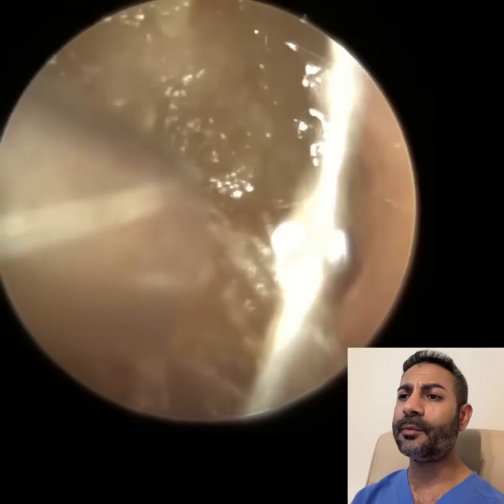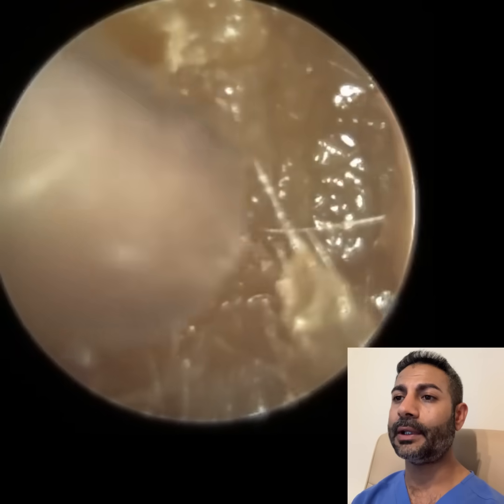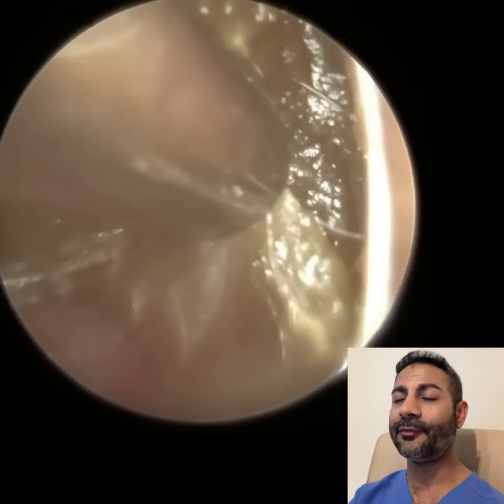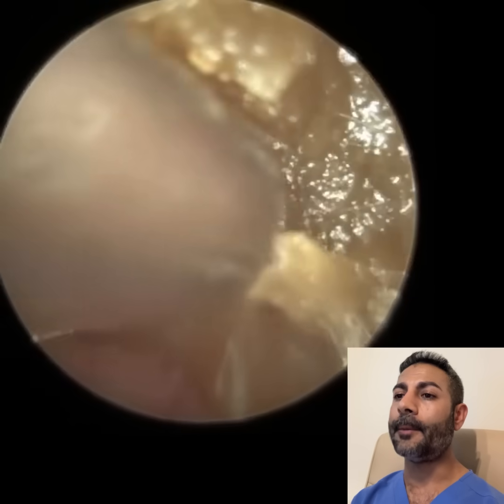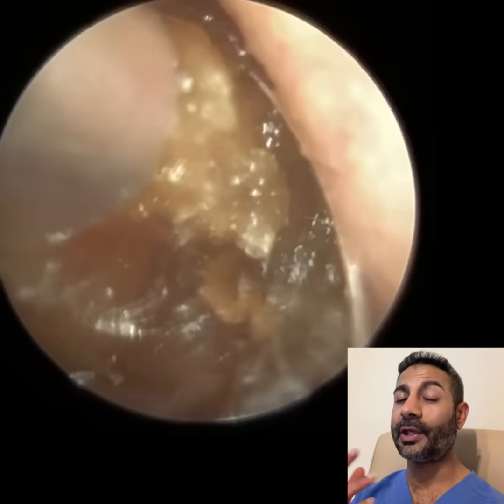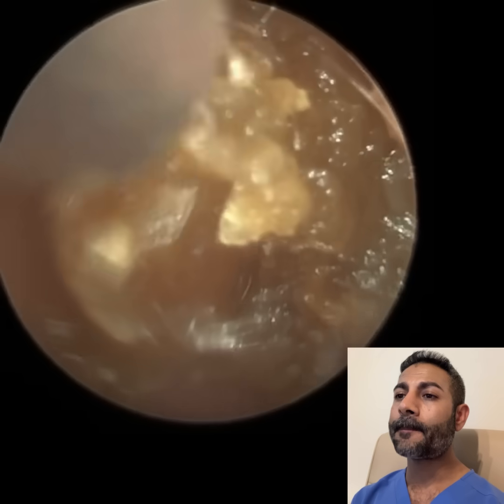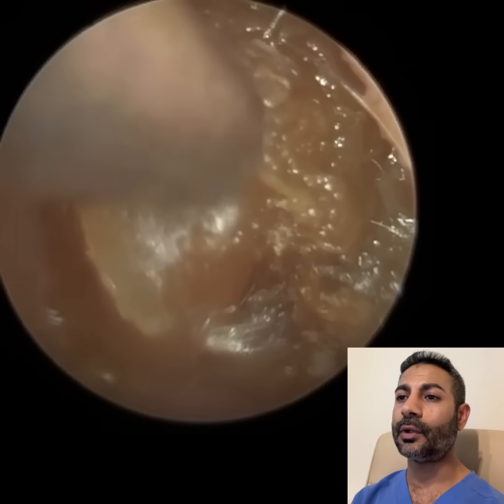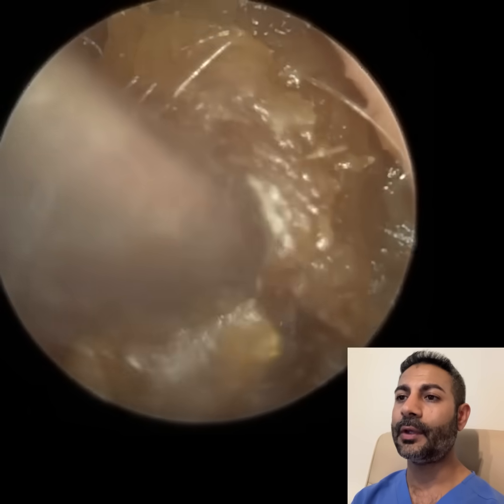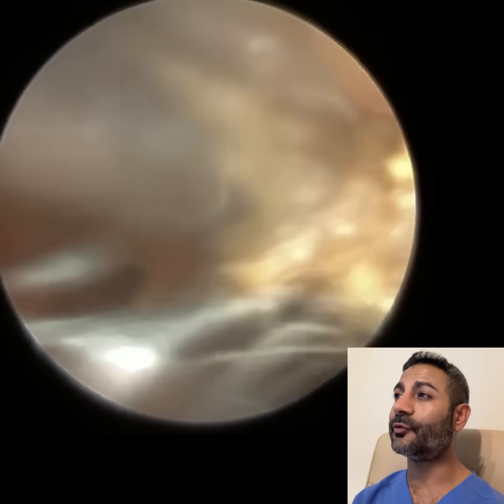An osteoma is somewhat different from exostosis. An osteoma is normally just a single bony growth — a bit like the left ear here, if truth be told. It's normally unilateral, one ear, solitary — just one of those. Again, they're harmless, non-cancerous bony spurs. They can also develop around the sinus and nasal region, and around the skull.